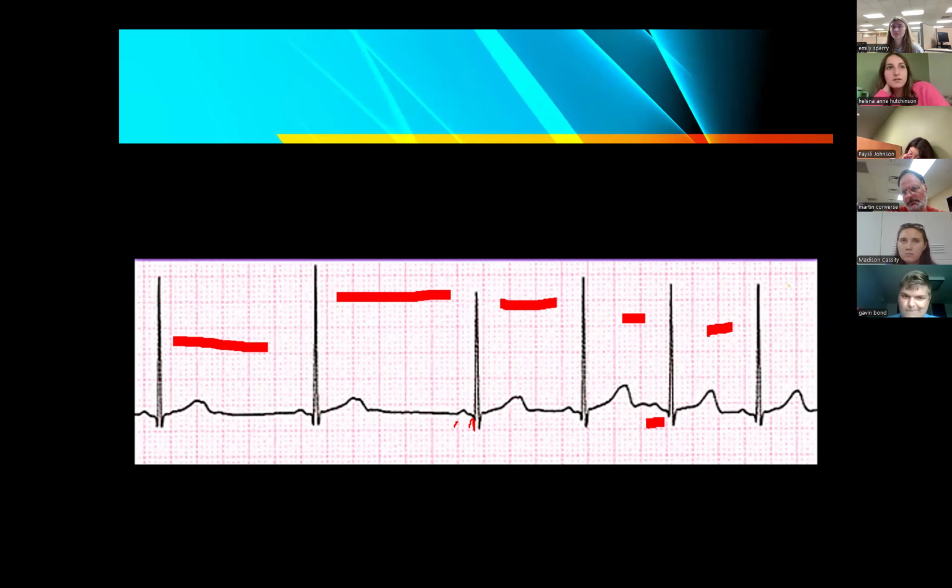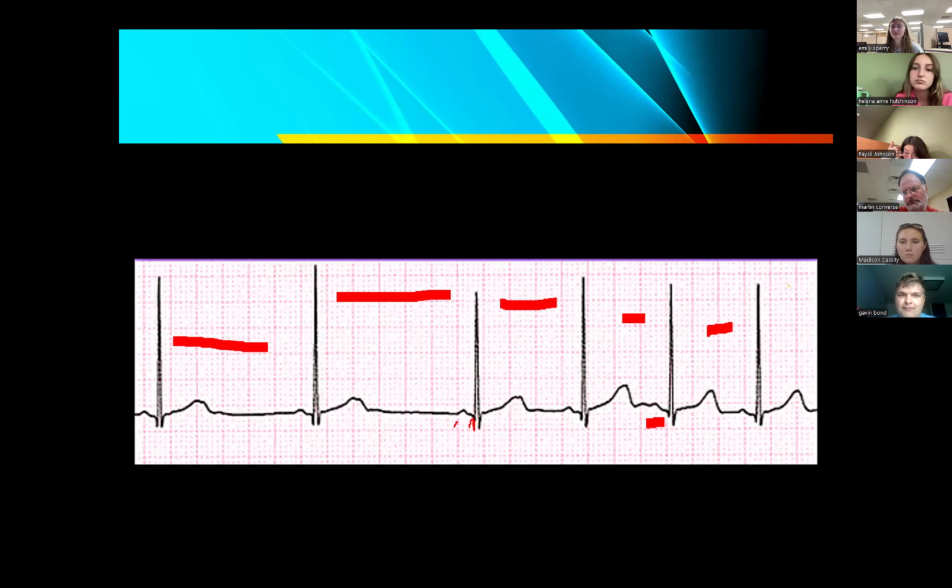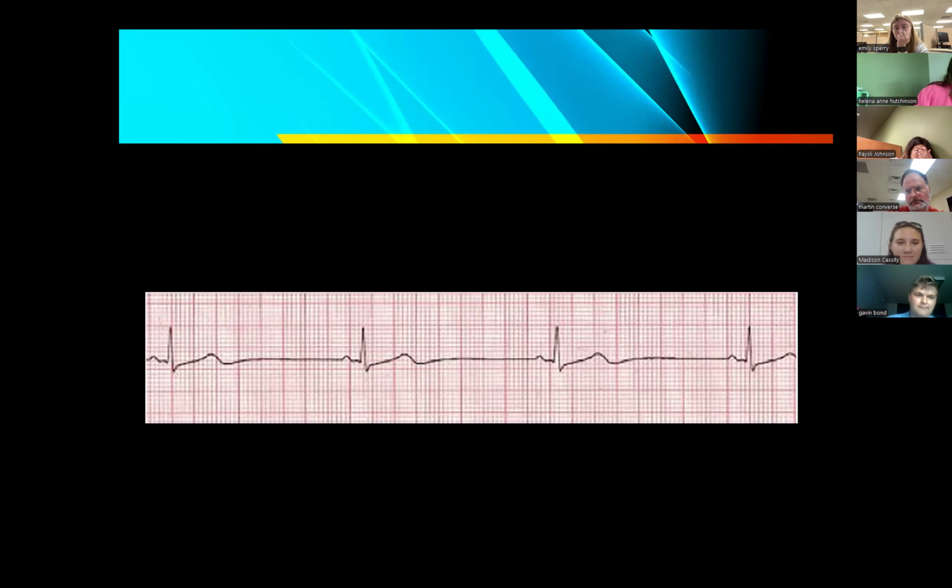Okay, so Gavin, what would you identify this rhythm as? Remember, it's one of the sinus rhythms that we've already talked about. Sinus arrhythmia? Perfect. You are exactly right. Sinus arrhythmia. Very good. Now, again, anybody not see why that's sinus arrhythmia?